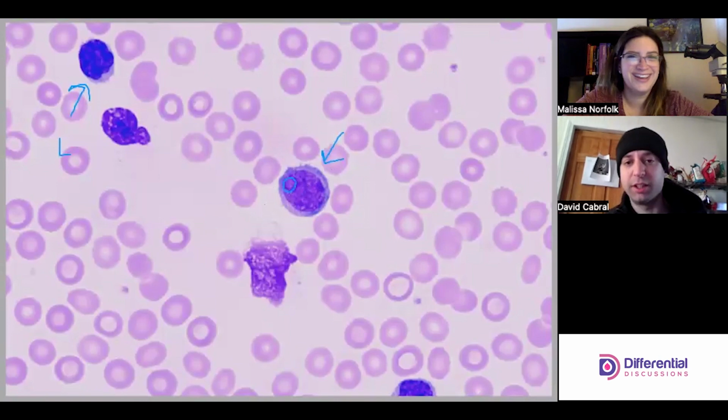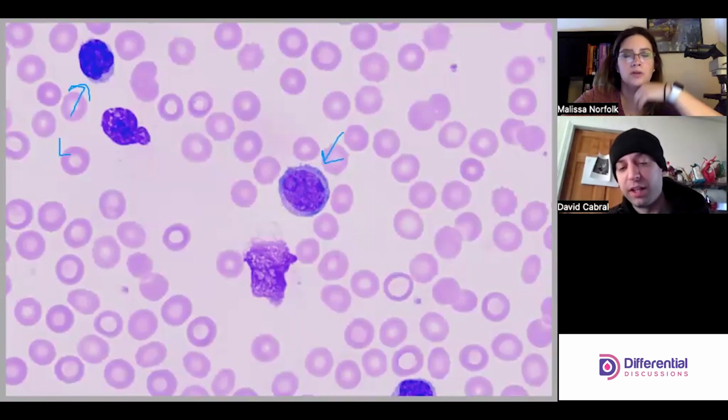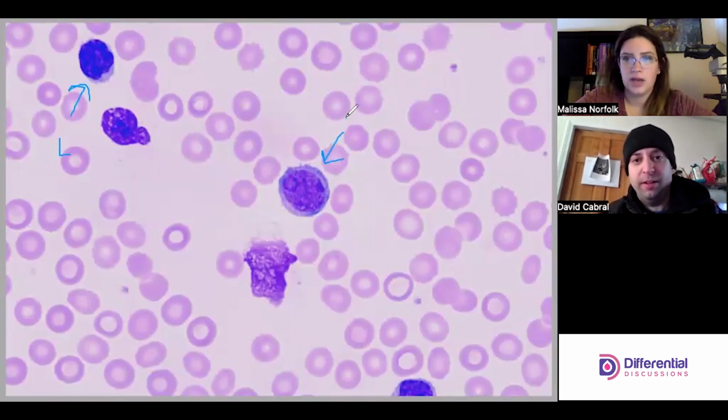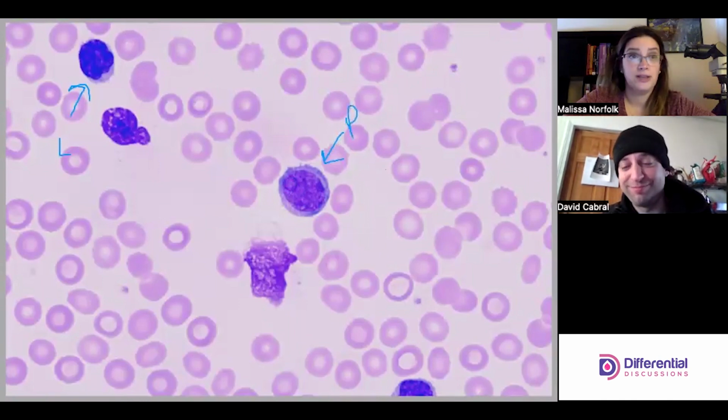Yep, it's significant. The other thing I forgot to mention is the cell size. Less mature cells are typically a little bit larger, so that's another indication that it's likely a prolymph. And it's definitely much larger than these little resting lymph guys. So we've got a nice looking prolymphocyte over here, and it's exciting that we got to see it on a regular prep.